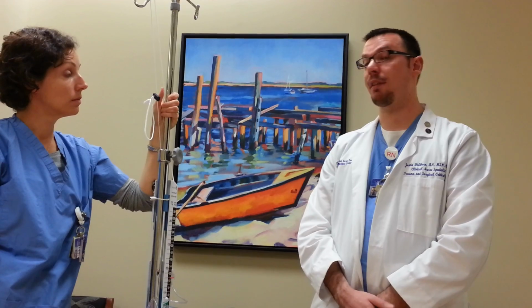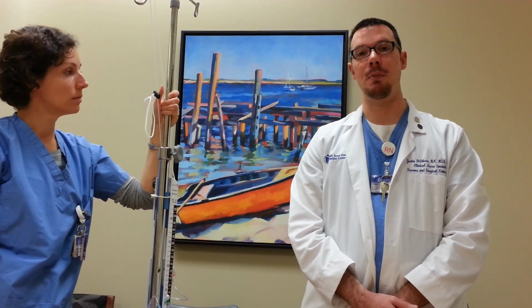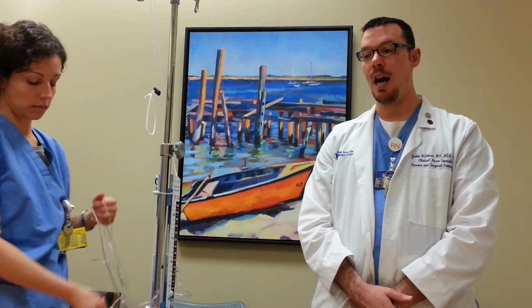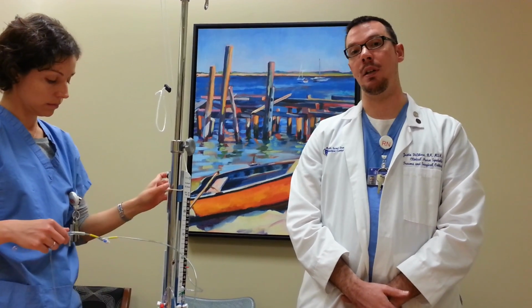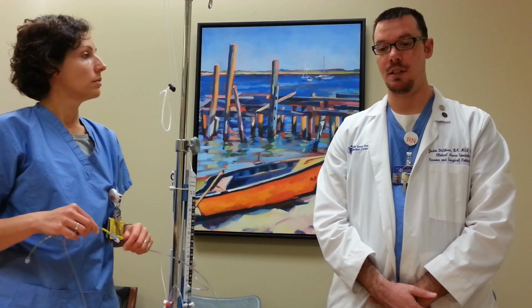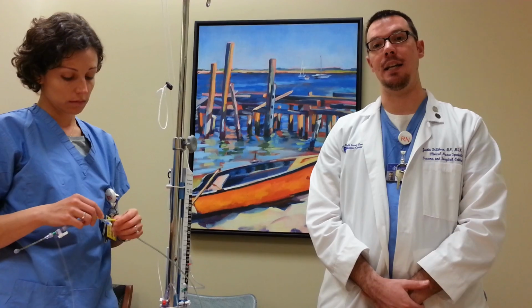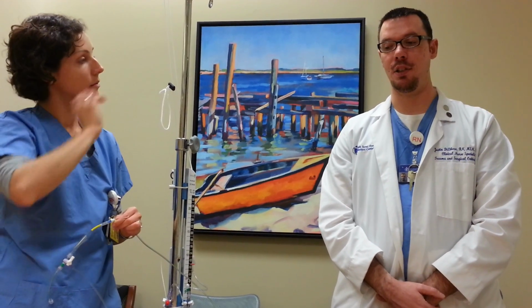So I think that covers everything related to overdrainage and underdrainage, but a few words about other general practices with EVDs is the risk for inadvertent access. And this has been identified as a significant problem and reported in the literature from across the country. In one instance, and this didn't occur here, a very experienced critical care nurse was setting up an EVD and an IV infusion and was distracted in the middle of the procedure.